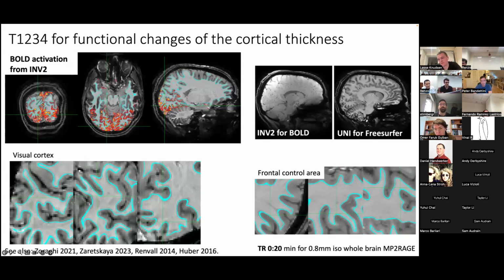It doesn't vary in a consistent direction. We do have the data for the repeatability because it's a very long experiment. The sneaky point of why it's cool to include that is that I think it's just a T1 change, that's just VASO. It's always just a different T1 value that you have during activity.